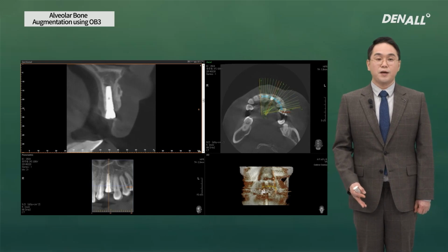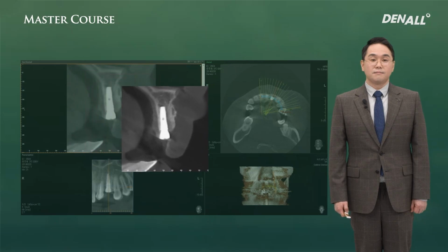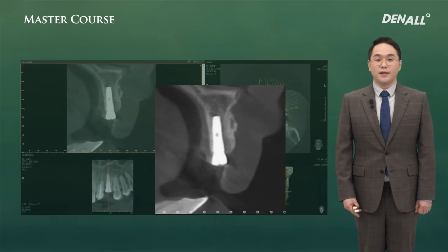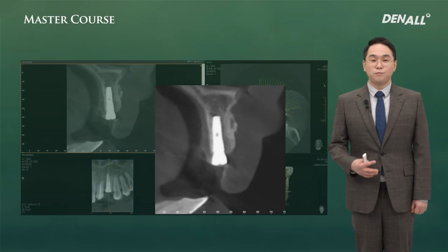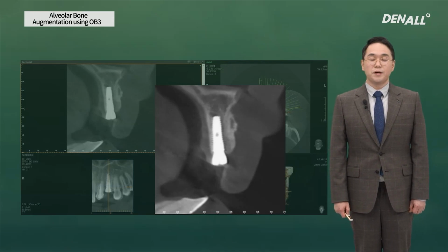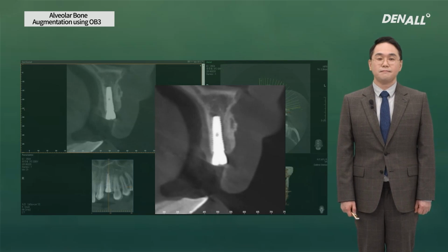As you can see, outside, the low temperature sintered EOS xenograft was positioned, so it is not resorbed, and the augmented labial bone volume is very well maintained. So when the defect is very wide-ranging and unfavorable, or more stable bone regeneration is desired vertically or horizontally, this special type of Ausbuilder, the Jawbuilder, can be a good option to use.